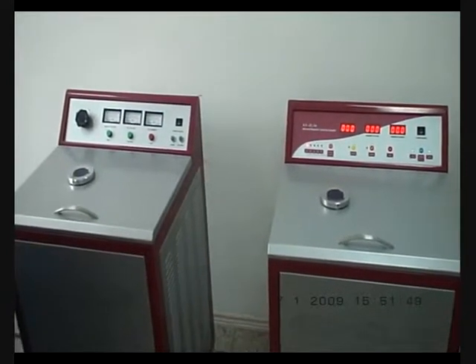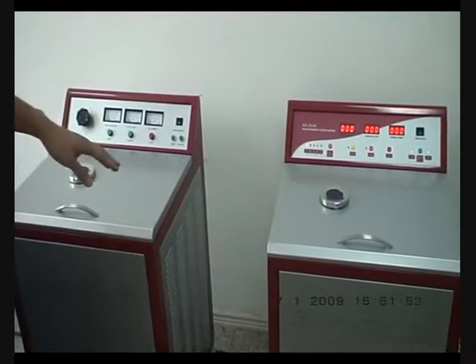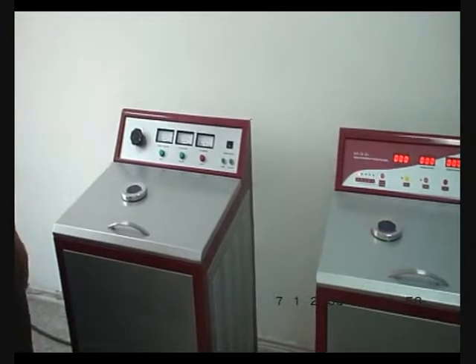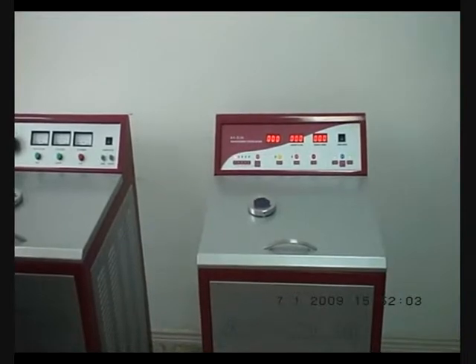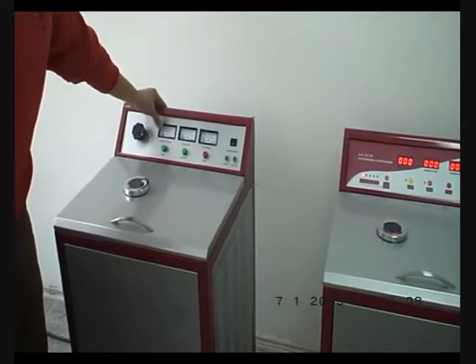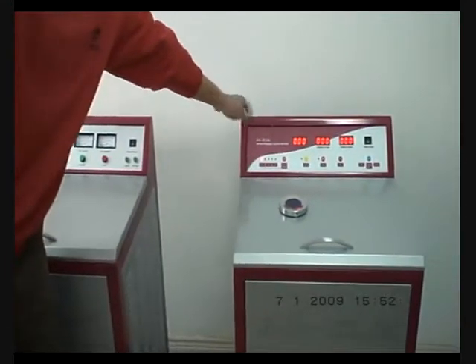This is the instruction video of the casting machine. There are two casting machines here: this casting machine is XZR3 and this one is XZR3A. The only difference between these two casting machines is that the display of the XZR3 is analog, and the display for the XZR3A is digital.